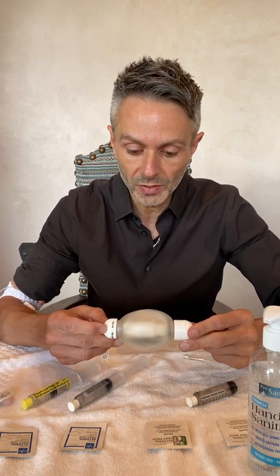Hi, I'm going to show you how to administer your IV medication at home using an elastomeric pump. That's what this is here.